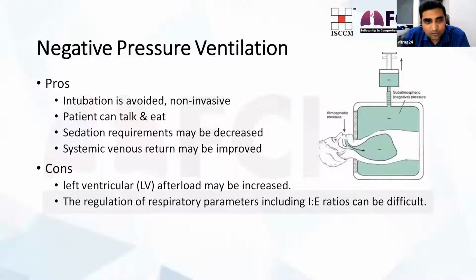What are the pros and cons of the same? Pros: intubation is avoided. It is non-invasive. The patient can talk and can eat. There is no sedation or minimum sedation requirement, and it is physiological, so venous return would be improved. But what are the cons? Left ventricular afterload will increase, and regulation of respiratory parameters, including IE ratio, would be difficult.